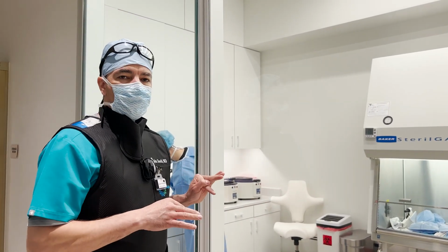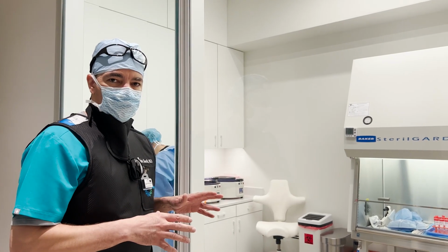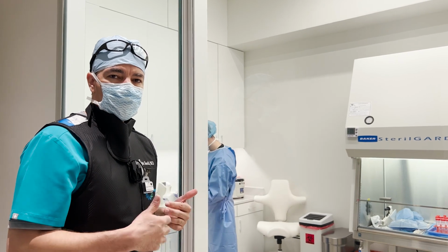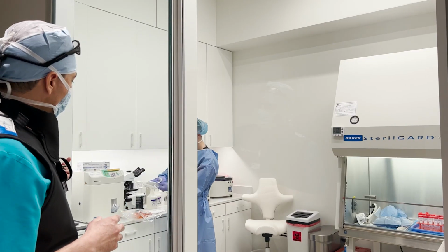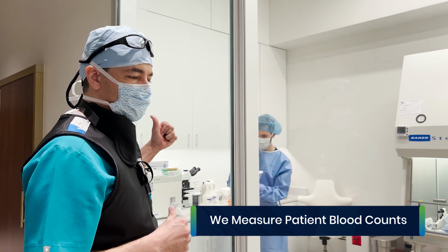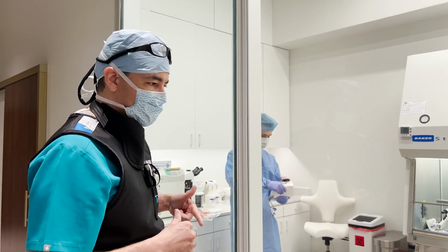This is atypical. We're the only lab in the state of Oklahoma that actually even has a lab like this that allows us to process this in the safest manner. A couple of other key things. We've already measured the patient's blood counts, so we know from that factor, we're aware of what his platelet count is, what his hemoglobin is.